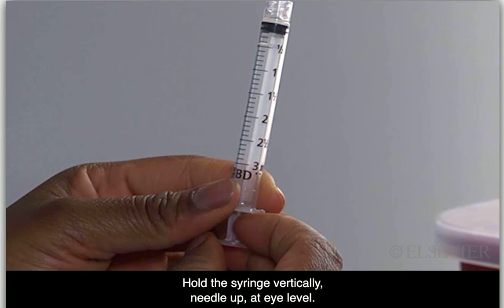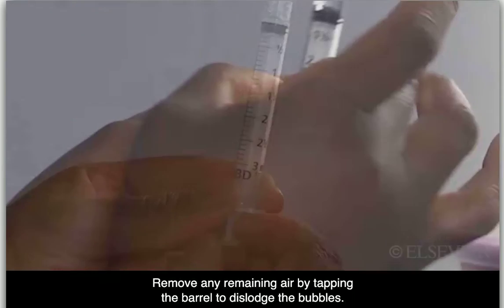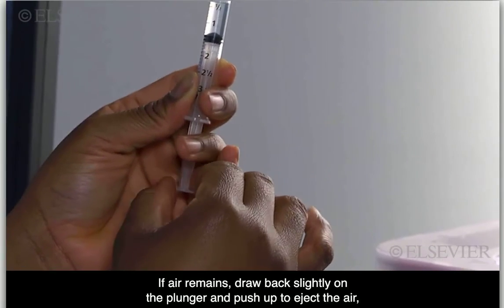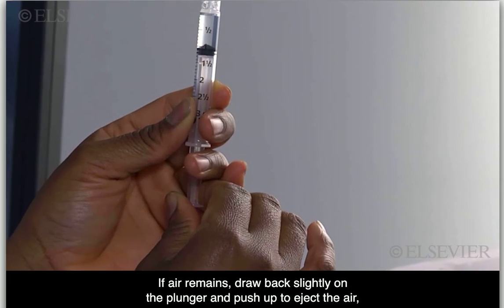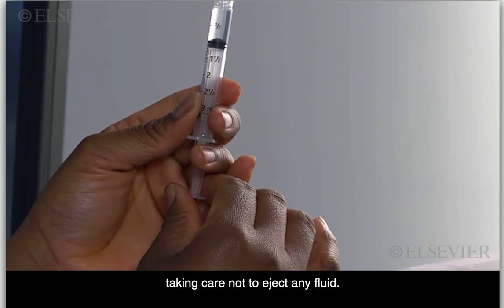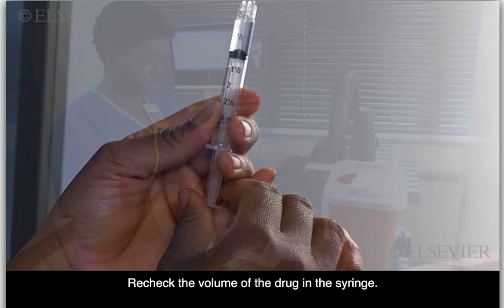Hold the syringe vertically, needle up at eye level. Make sure you have the correct volume and no air bubbles. Remove any remaining air by tapping the barrel to dislodge the bubbles. If air remains, draw back slightly on the plunger and push up to eject the air, taking care not to eject any fluid. Recheck the volume of the drug in the syringe.